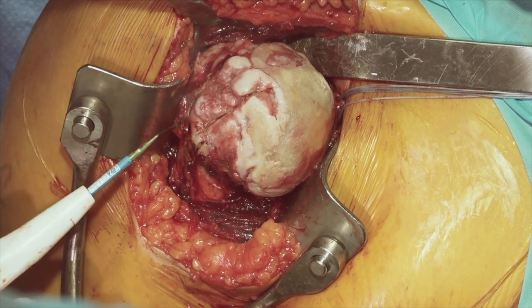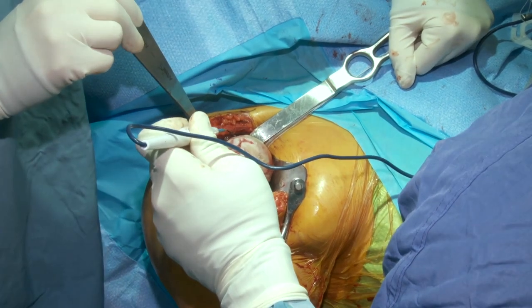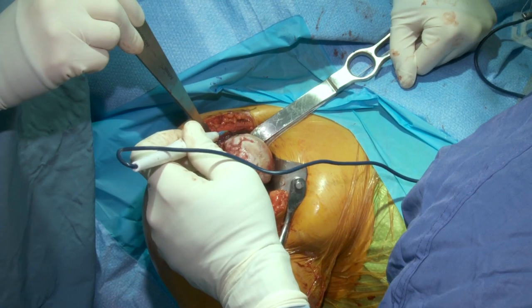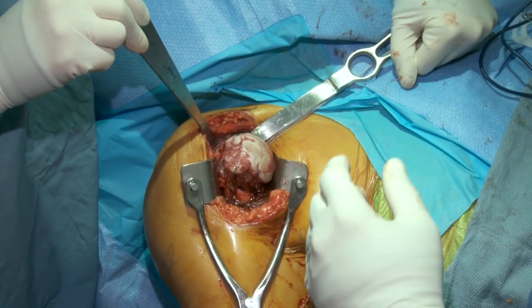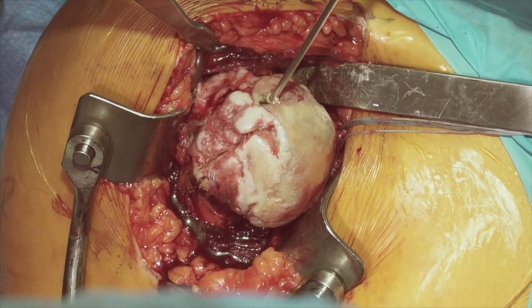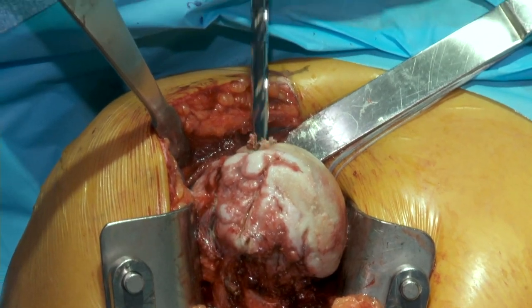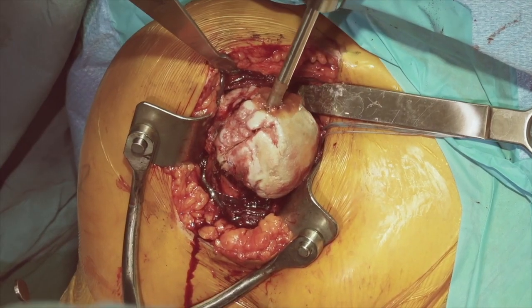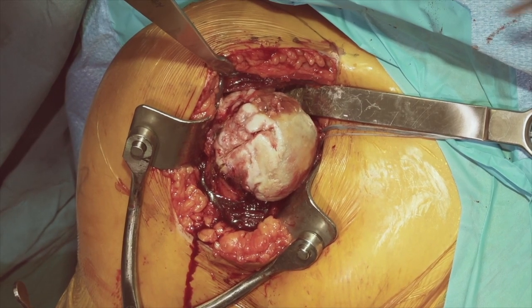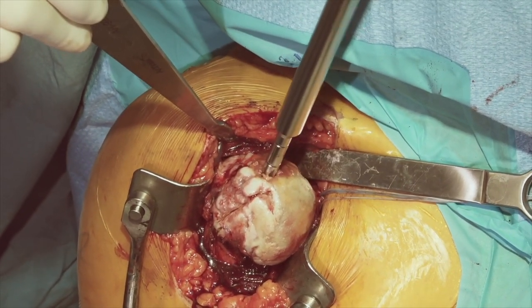A systematic review of the world's literature suggests that the overall range of motion clinically is the same between the two inclinations. We prefer the 135 in the majority of our patients because we can avoid notching, which may play a role in late loosening of our glenoid components. To identify exactly where we need to go down the canal, we can see our bicipital groove here, then come just anterior and toward the center of the humeral head to identify the humeral canal. We'll get our guide pin to go down through the center of the humeral canal and start with our smallest reamer, the size 5.